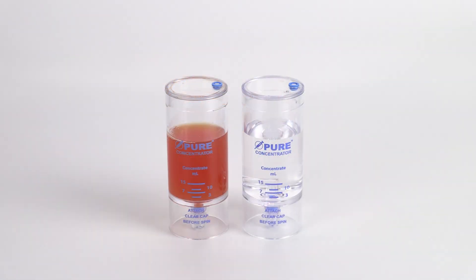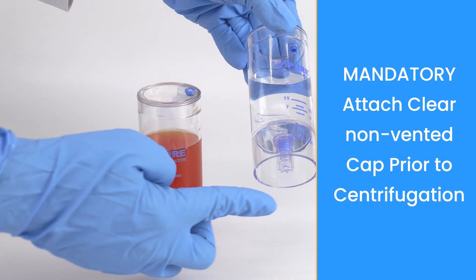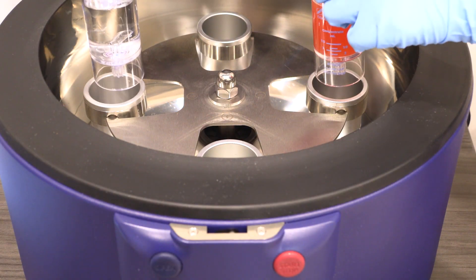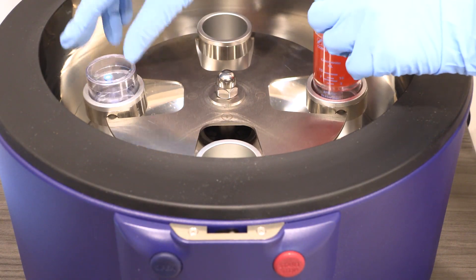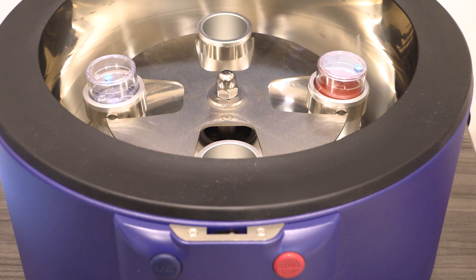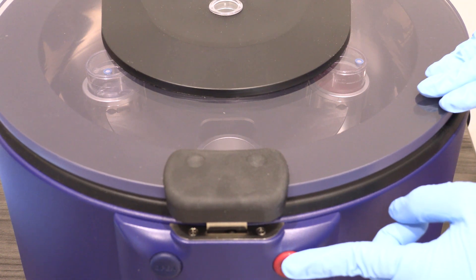Counterbalance the concentrator device with equal volume and place into the centrifuge rotor at opposite ends. Follow the protocol settings provided in the Pure2 IFU insert. Close the centrifuge lid and press start.